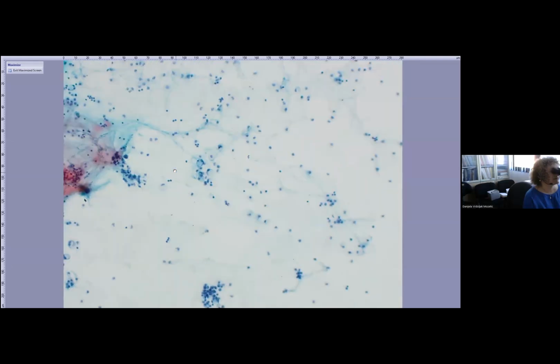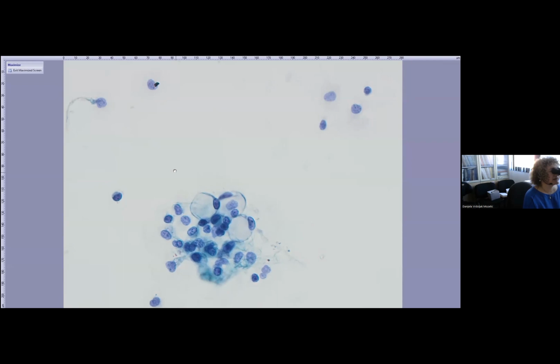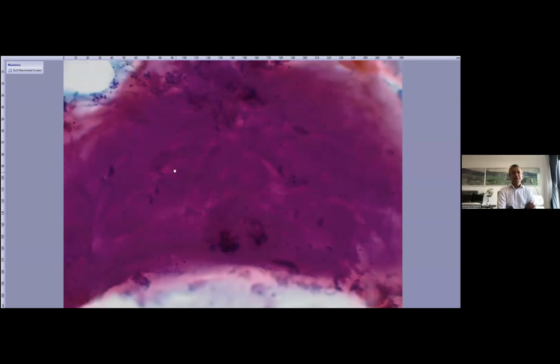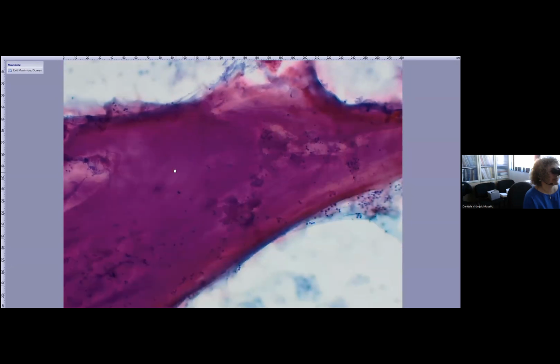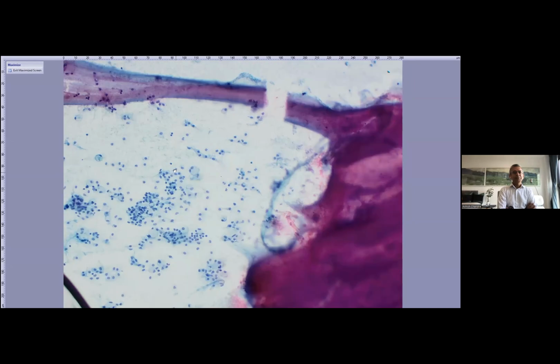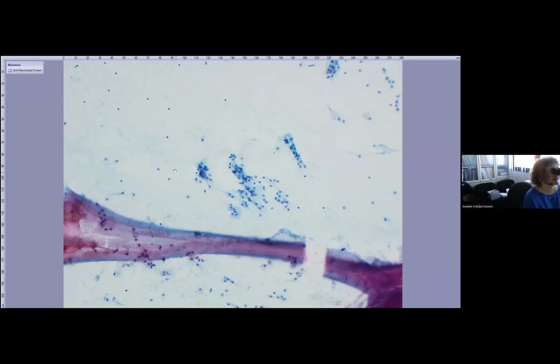Yes. So indeed, a few of these cells here. But you can really wonder, are these tumor cells or macrophages or something? That's right. But absolutely, they are bigger than the surrounding lymphocytes and mesothelial cells. But if in doubt, obviously you can do some epithelial markers. Sure.